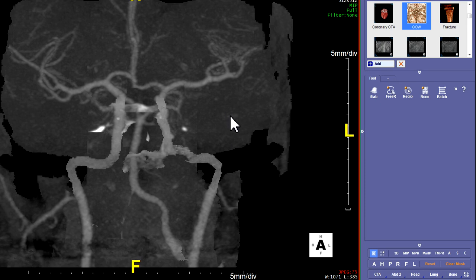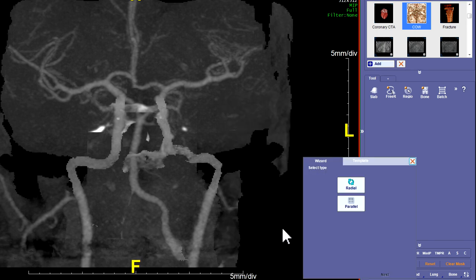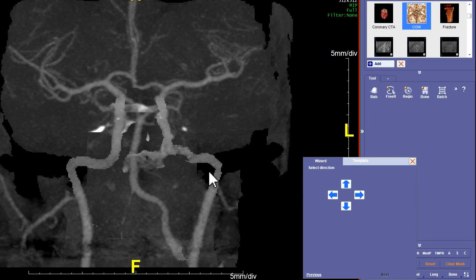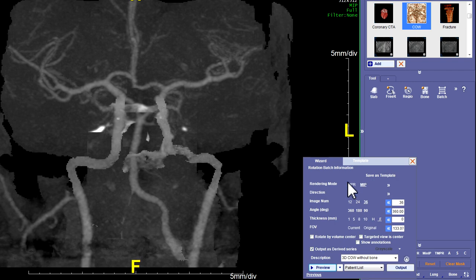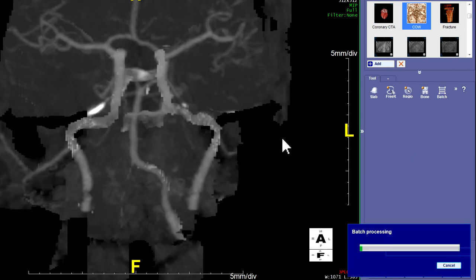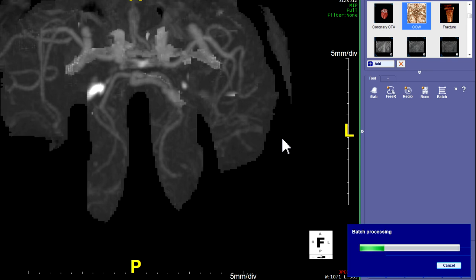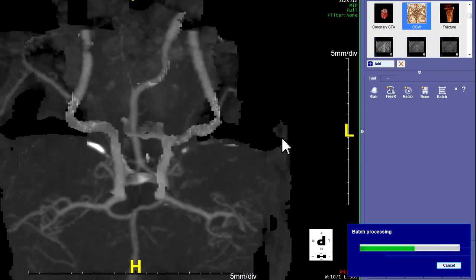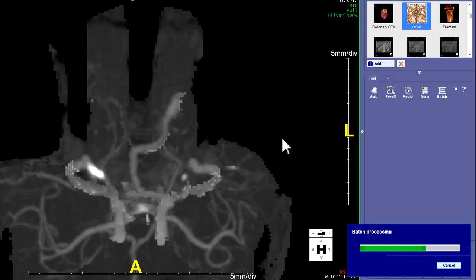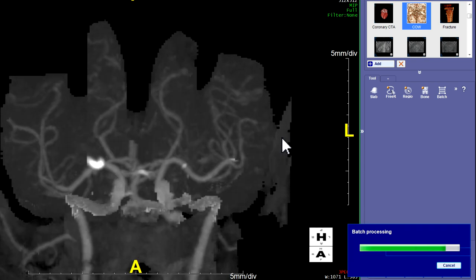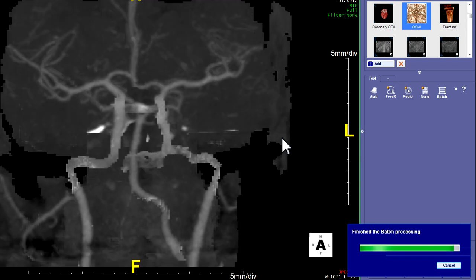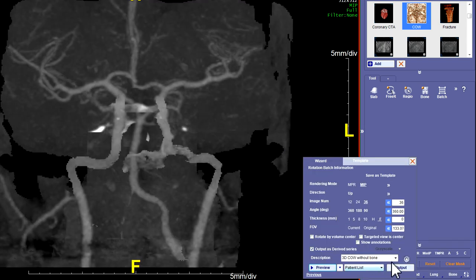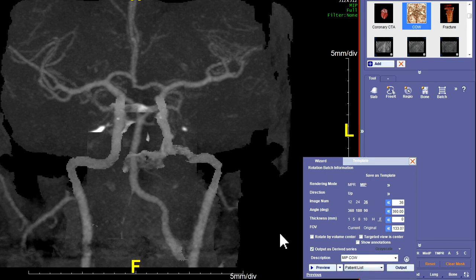We can use the batch wizard again. Let's do radial reconstructions — just always start from the anterior view for these batch wizards — and let's go up first. It remembered everything. Hit preview, make sure it's staying on there. That's pretty good. Maybe we could make it a little smaller, move back a little bit, but that looks pretty good. Then you hit the output to send it. You'd have to change the name to MIP-COW, and then hit the output to send it to the patient list.